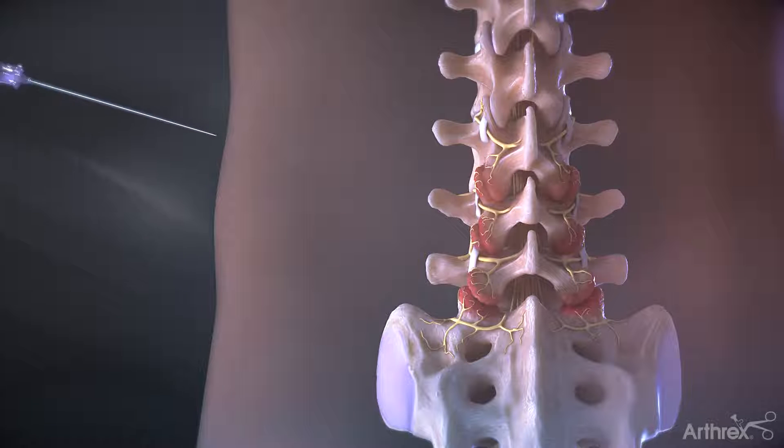Insert the spinal needle, docking at the junction of the transverse process and facet. Remove the stylet and pass a guide wire through the spinal needle. Remove the spinal needle.